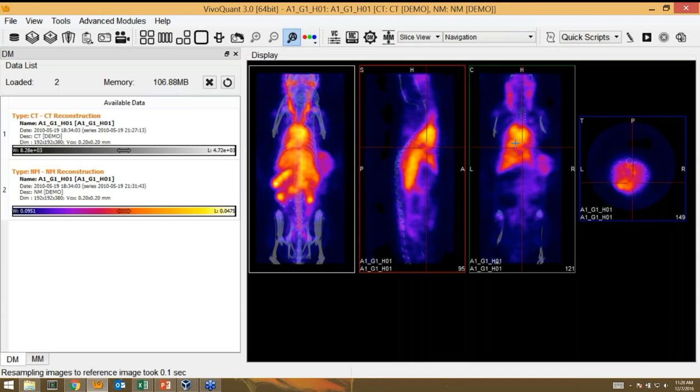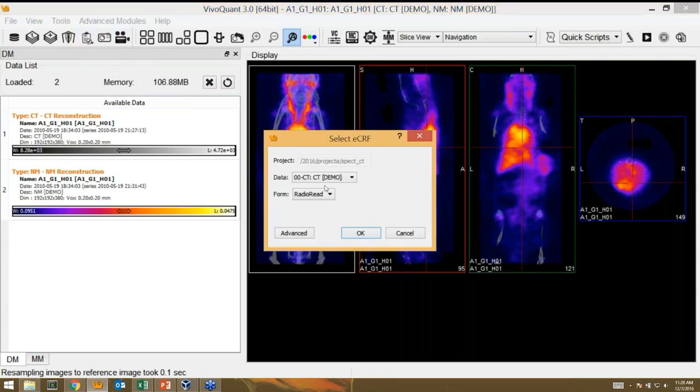but can also be included in QC of, say, regions of interest. If you have a large team drawing regions and want one person to review them, it would be fairly straightforward to write up a form to review these ROIs and provide feedback. So here what we'll do is create a new form. It knows what project the data came from, and I can specify which of the loaded data sets I want to submit a form for.